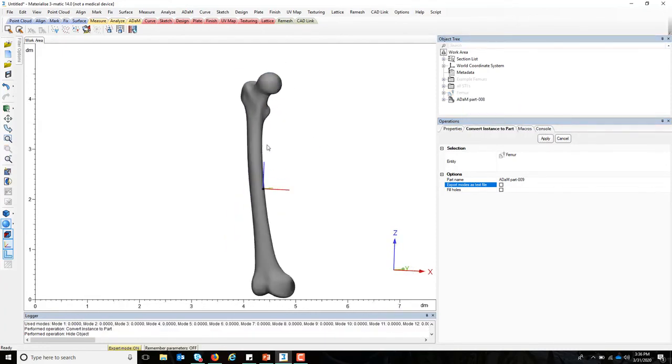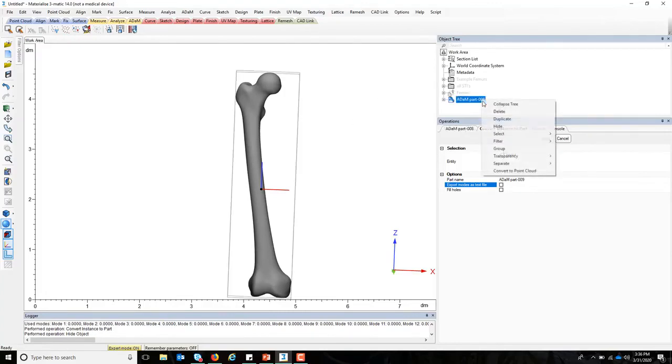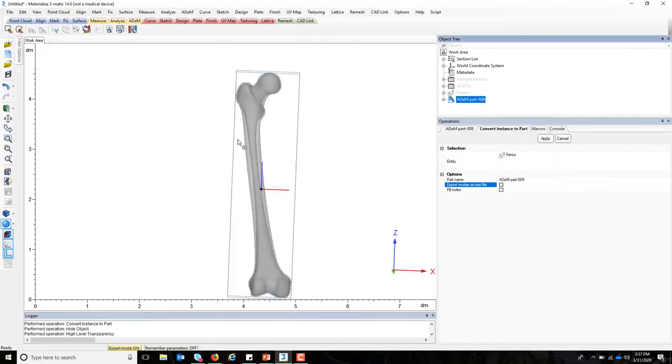Once you have an STL file in 3matic, you can take measurements, you can perform resections, you can implant your device, and really go all the way as needed for the R&D of a new device.